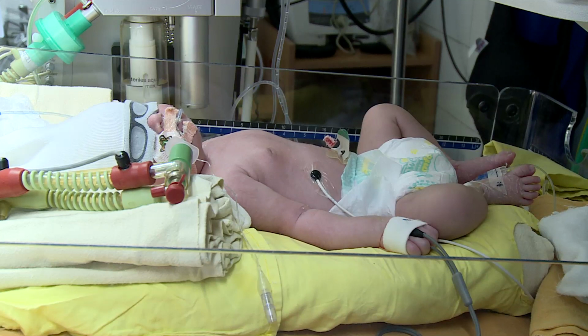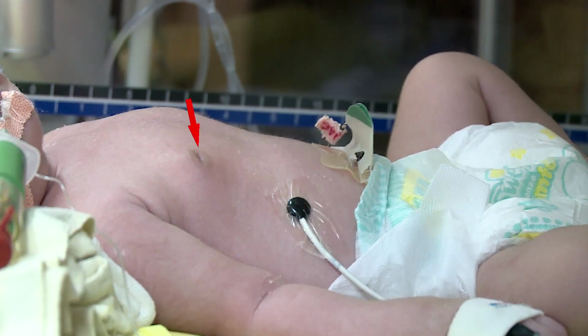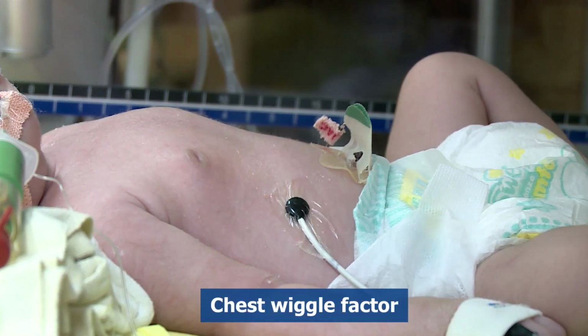With the initiation of HFO ventilation, there is continuous and equal vibration in the chest from the nipple line to the umbilicus in neonates, and from clavicle to hips in the pediatric age group, known as chest wiggle factor.